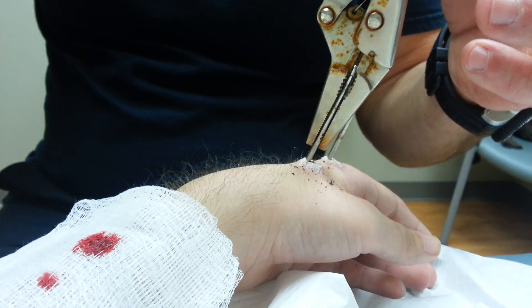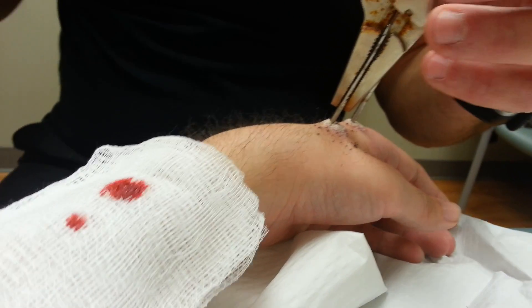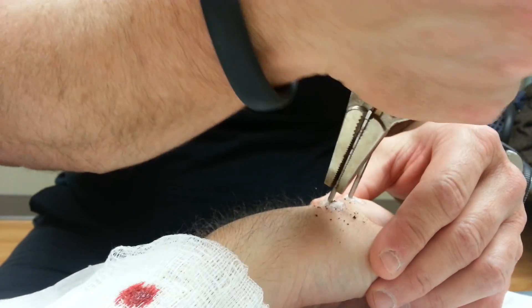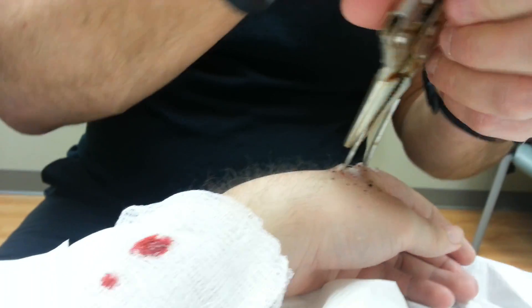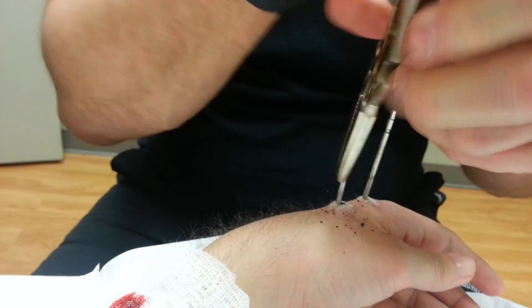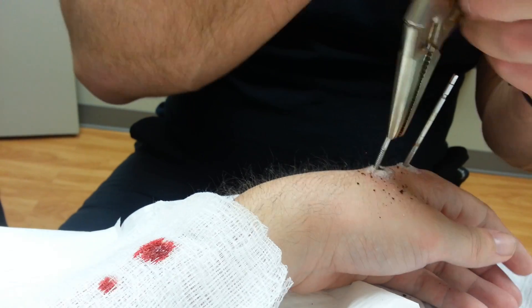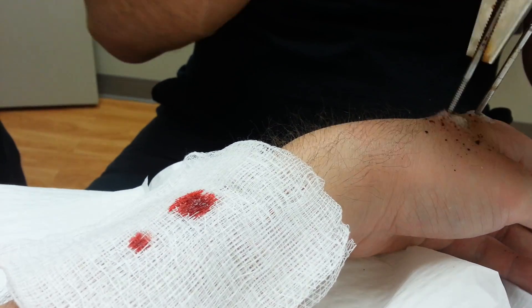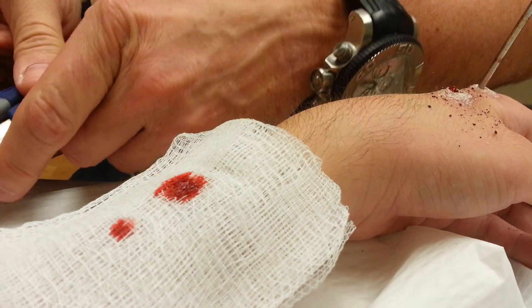Okay. And this one is best to twist it out like a screw. If they're smooth, then we can just pull it straight out. Now this one's usually just a little bit more tender in your hand. It's going to pinch right there when it comes to the skin, okay? You should feel your hand so close — that one's just bad.